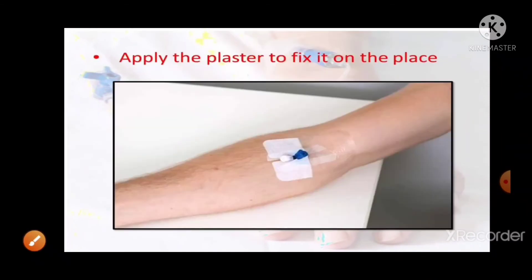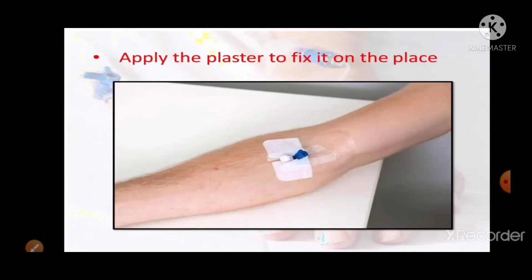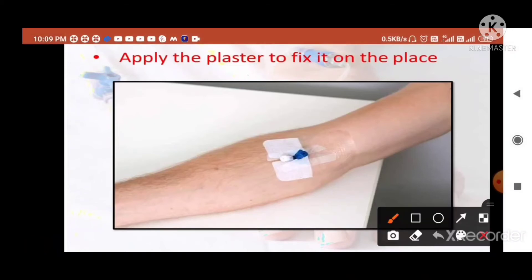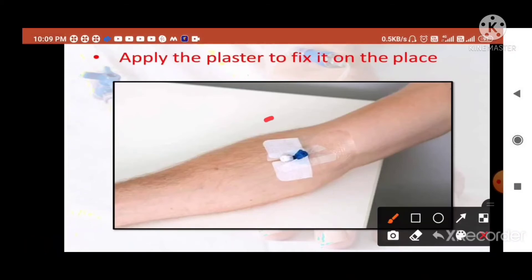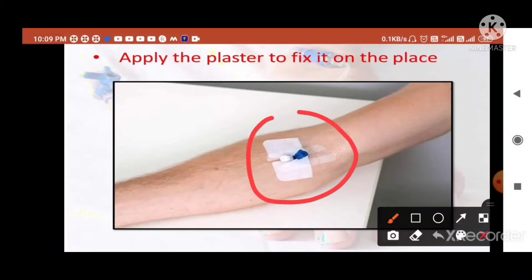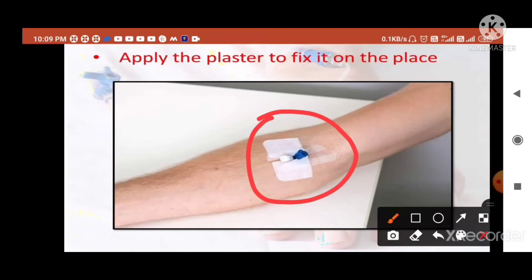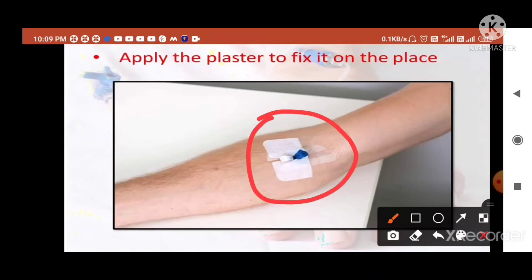Apply a plaster to fix the cannula securely in place.